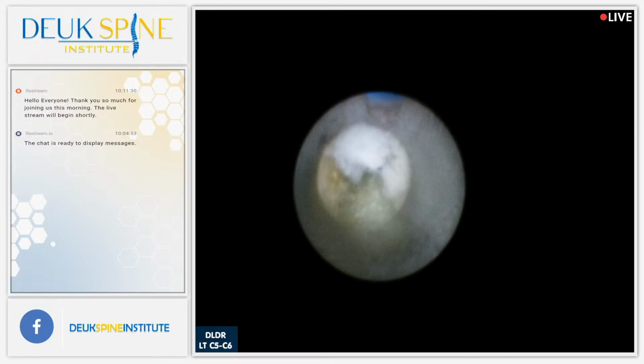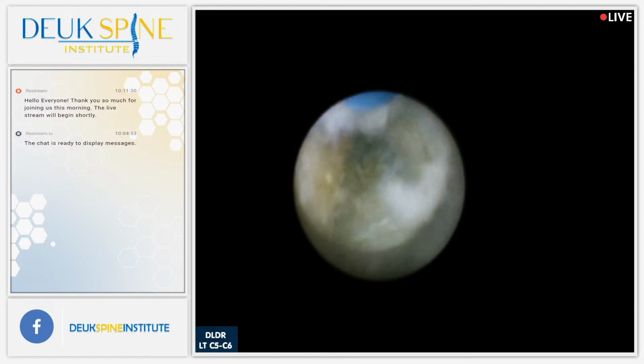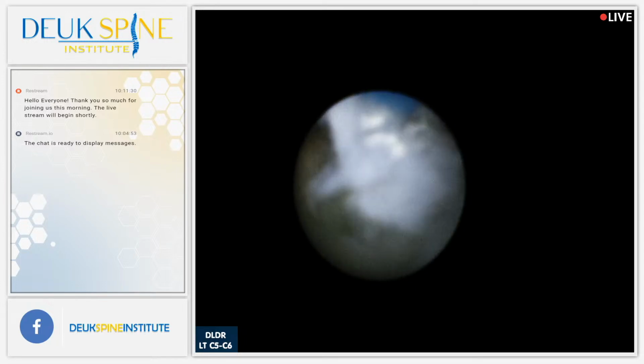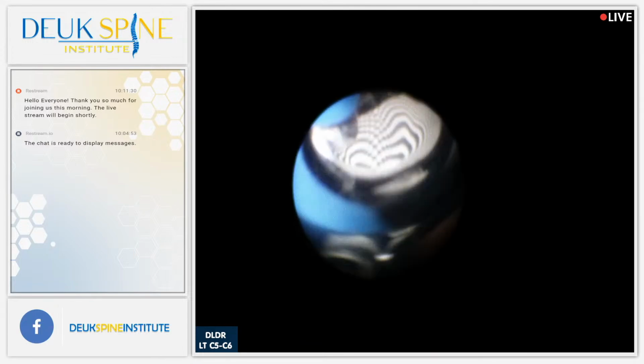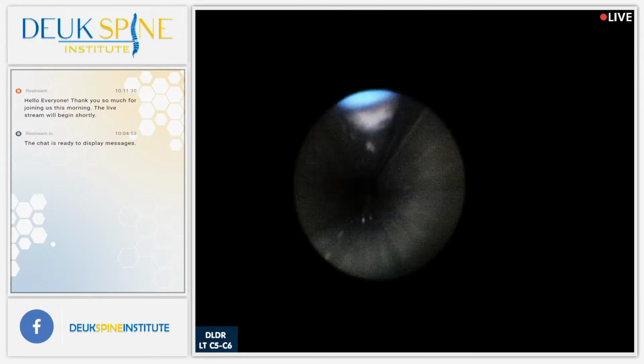I think we're done, Dr. Berndez. So, yeah, I'm sorry, I should have told you a little sooner, but I think we're done. I'm just going to go one more time and look, but we're done pretty much.